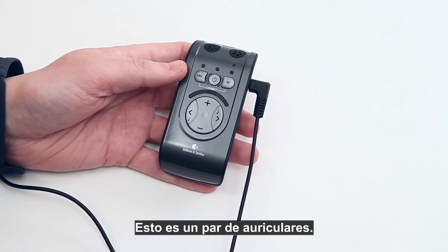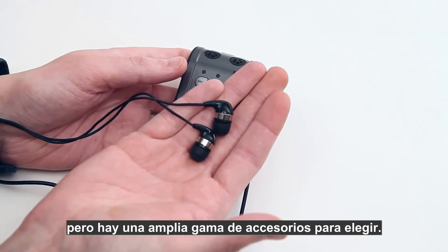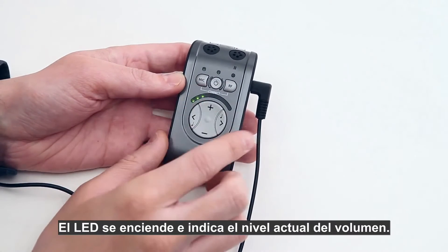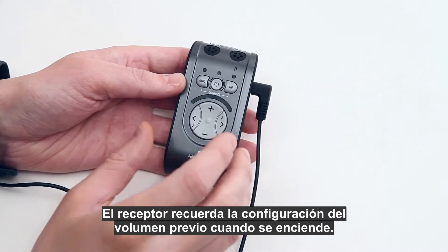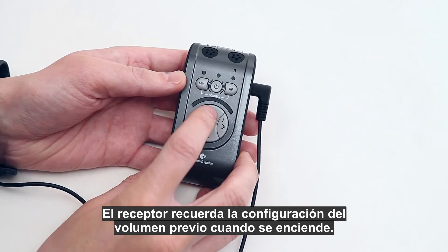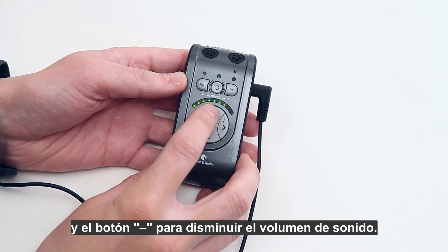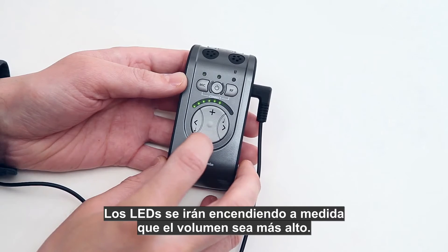This is a pair of earphones, but there is a wide range of listening accessories to choose from. Press and hold the on/off button to start the receiver — the LED lights up and indicates which volume is currently set. The receiver unit recalls your previous volume setting when turned on. Use the volume plus button to increase the sound level and the minus button to decrease it.